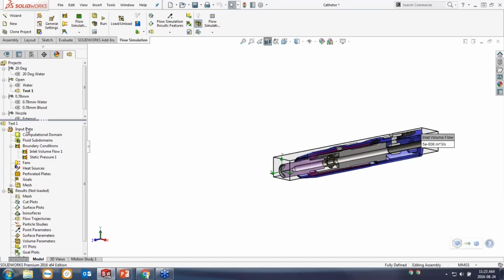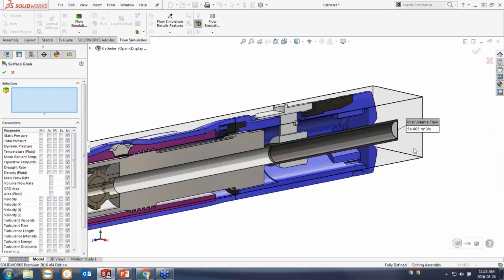However, there is an optional step, and I highly recommend using this optional step, and that is inserting goals. What goals are is you're telling the software what values are important to you. If you run the analysis without goals, SOLIDWORKS Flow Simulation has internal convergence criteria, and it can make sure that you reach those convergence criteria before spitting out an answer. However, by explicitly telling SOLIDWORKS which values are important to you, we can make sure that those are the values that converge, as opposed to what Flow Simulation decides should converge. So I'm going to go ahead and insert a couple of goals here.